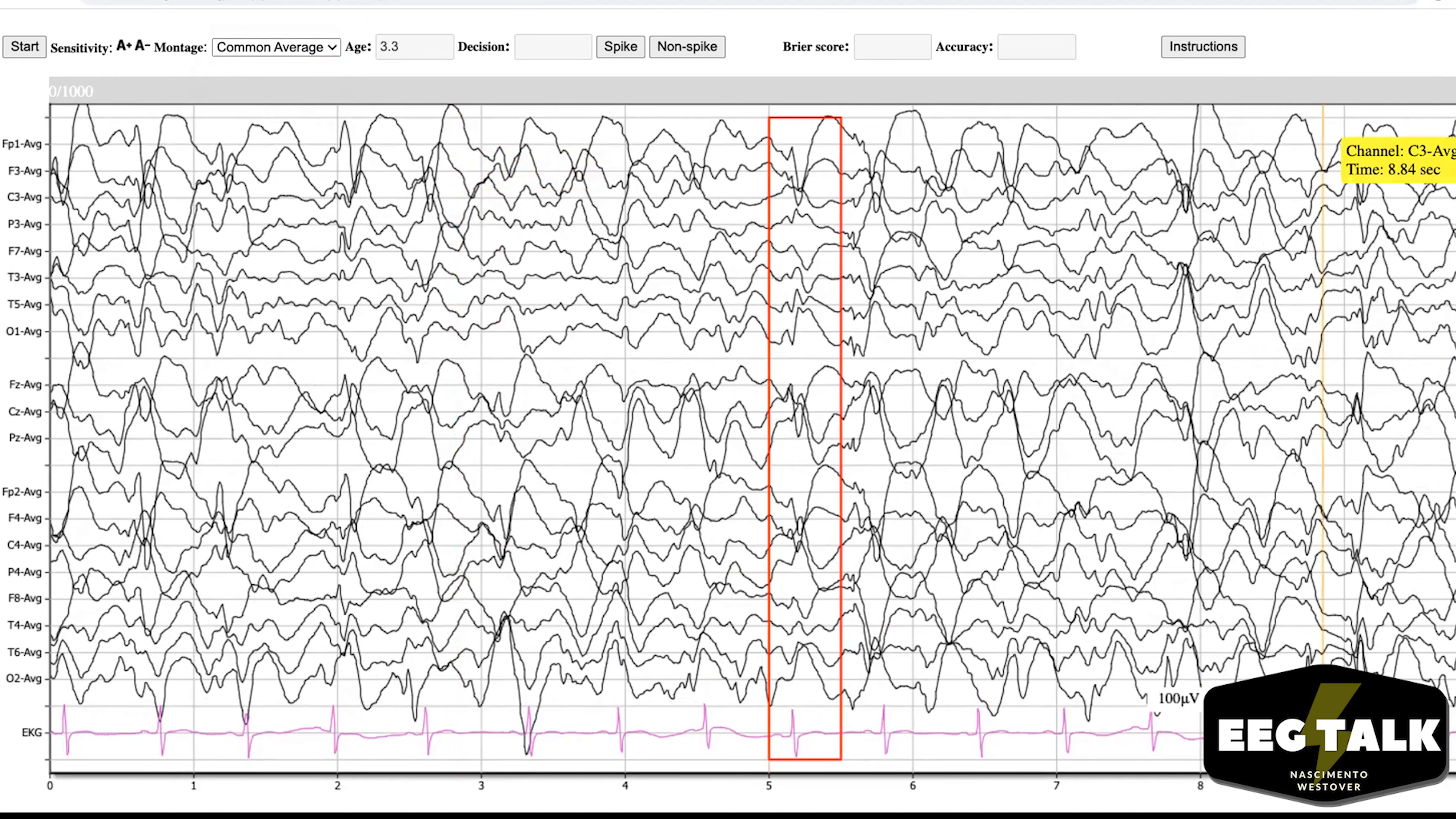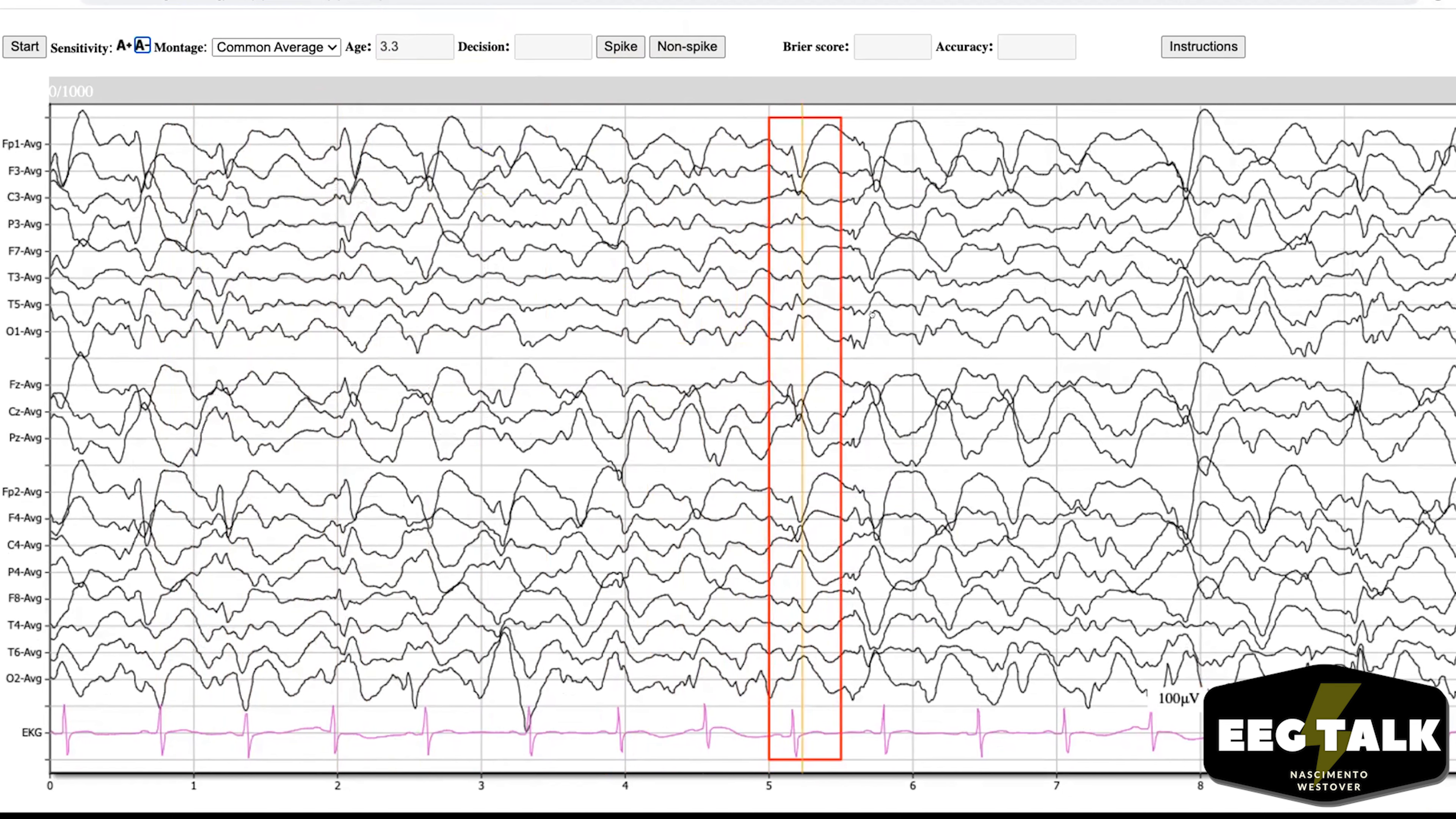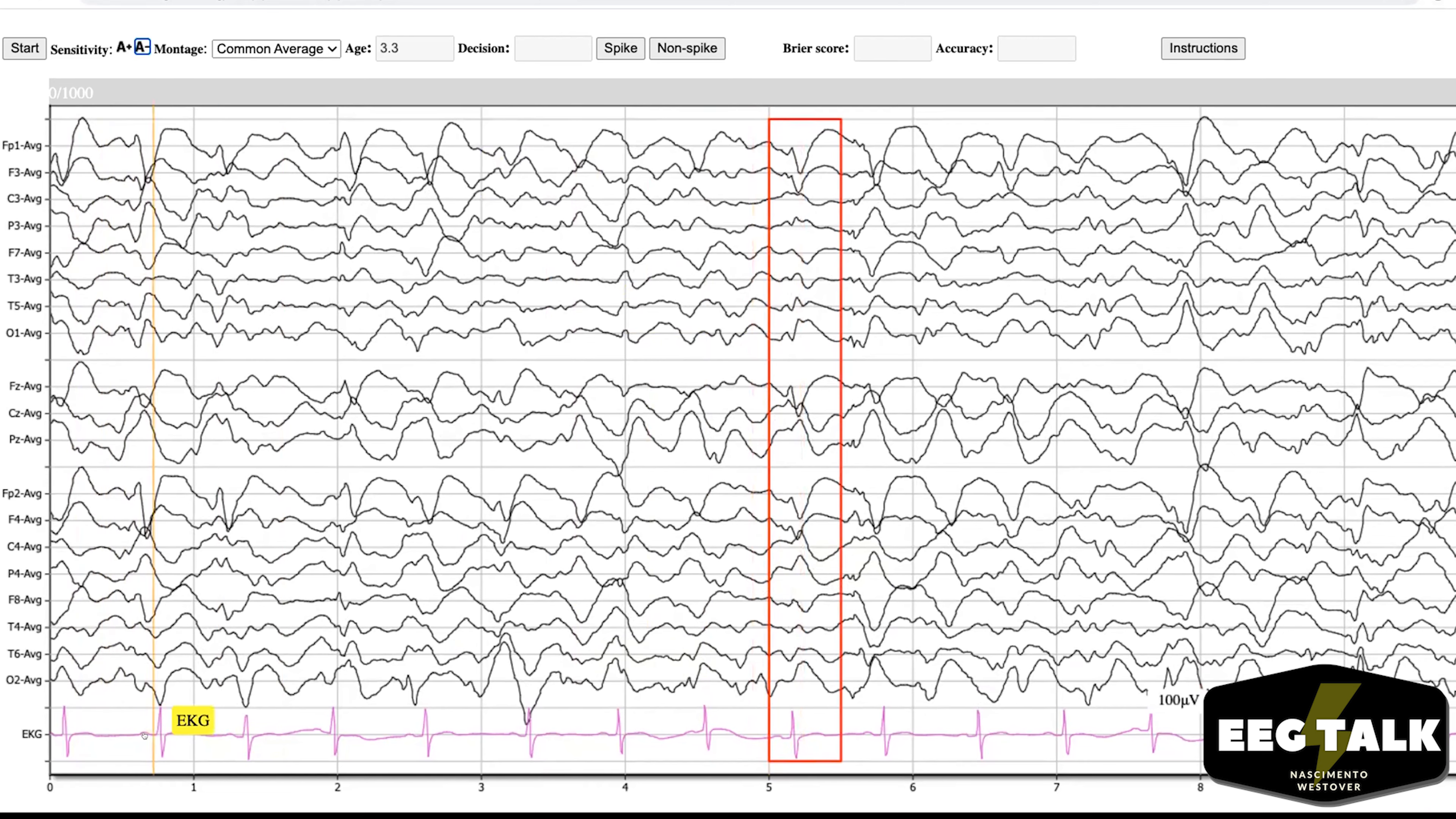Why don't we try a few? Don't tell us what the right answer is here. What's the red box? You're asked to vote only for the half-second data in this red box. We're not looking at these guys then? No, no. The 10 seconds is just to show the context of EEG to give you more information, because that's often very helpful. So if we see something maybe similar to what's in the box over there and we're sure that that's a spike, maybe that'll change our answer about what's in the box.